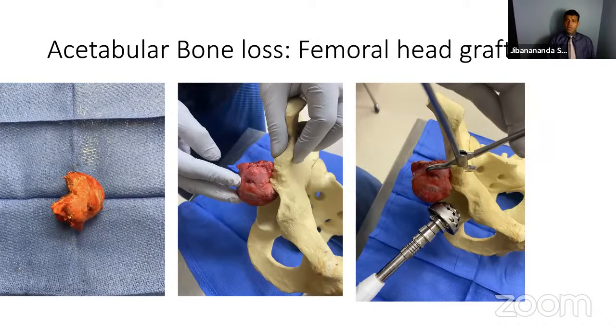You can use an allograft, or even, in primary hip situations with a lot of bone loss, an autograft; in revision situations, allograft. This is the technique. You can take the femoral head ball, you cut it on the side in the superolateral area like a 7. You usually keep the calcar area or the medial side because that's a stronger bone. And then this is attached to the side of the ilium or superolateral part of the acetabulum, where most of the bone loss typically is, usually secured with 2 screws.